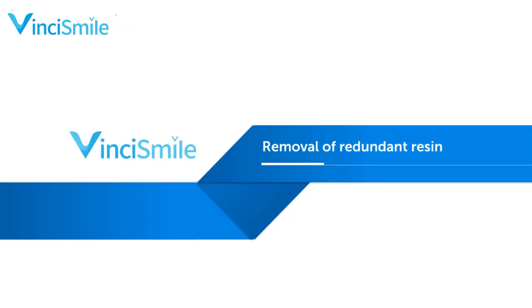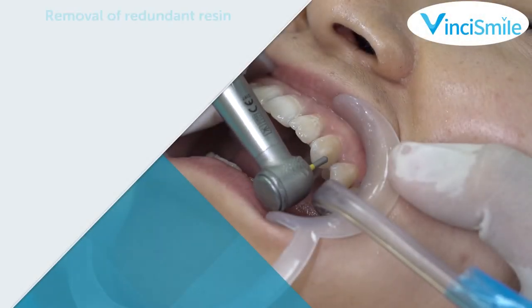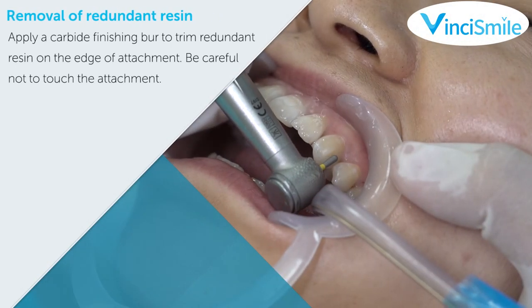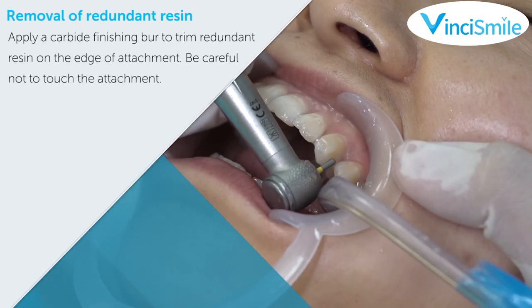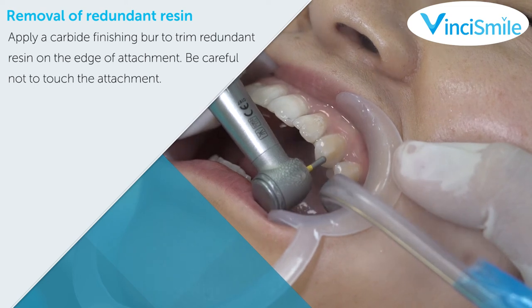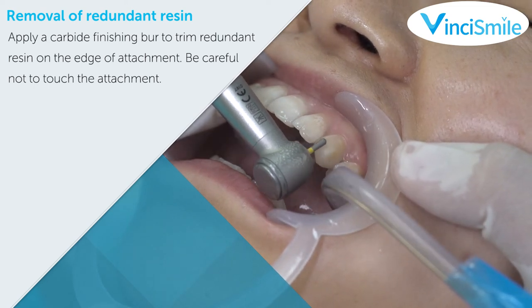Removal of redundant resin: apply a finishing bur to trim the redundant resin on the edge of the attachment. Be careful not to touch the attachment itself.